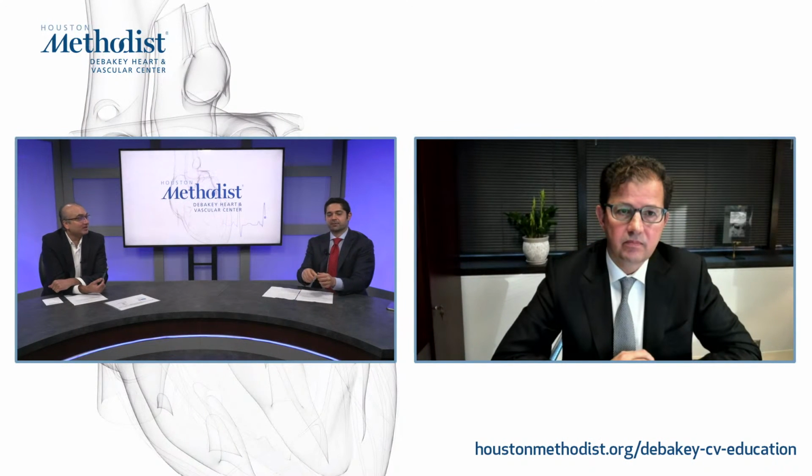Yeah. All right. Great. We'll give you time for one last question because I know we're running a little bit over. Thank you. There are some studies that show there are some changes of the MRI, especially T2 and ECV, very close to the transplant, associated with the inflammation post-transplant. And some of the T2 mapping stays abnormal in a transplanted patient even without rejection, even chronically for a long time after.